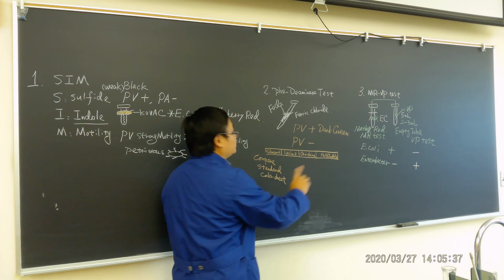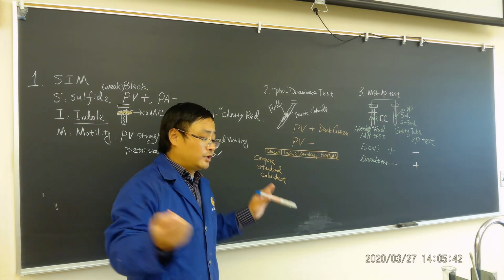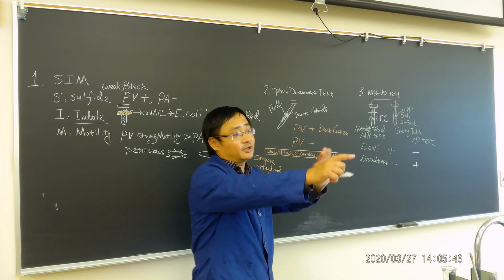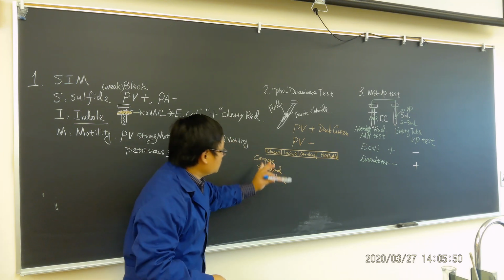So we're just gonna skip that. I'm not gonna give you a color sheet to compare, it takes too long. We have limited time. If it's a normal class, I usually give everybody a sheet to compare. We just skip here, okay? I just let you know how we do it.